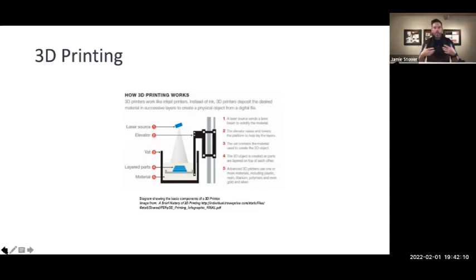So, well, how do we make it? It's a layer by layer process, right? So if you go to a movie theater and you're watching a movie and it's seamless, you're watching this movie play in front of you. If you look up into the projector room, you can see the light flashing. And if you were to go up there and pull the reel off the projector, you would see a bunch of individual frames of the movie. And that's essentially what happens when we print a part.